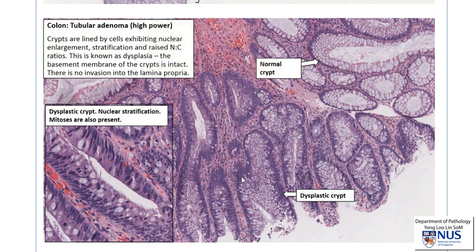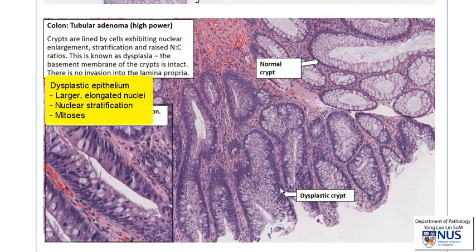As opposed to these crypts, where you can see that the nuclei are taller or longer and they occupy a greater proportion of the cell. At even higher power, the nuclei are elongated — almost cigar-shaped. The nuclei are not just located in the basal part of the cell, but also in the middle part of the cell and even close to the luminal surface. We also see mitotic figures, and all these are features of dysplasia.